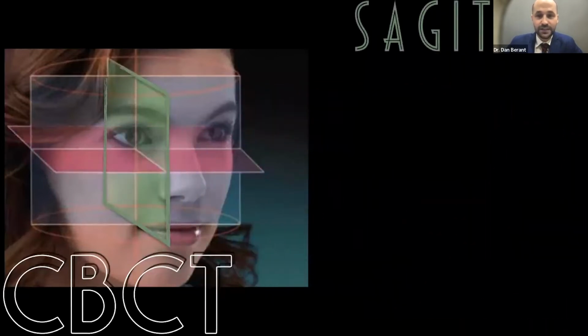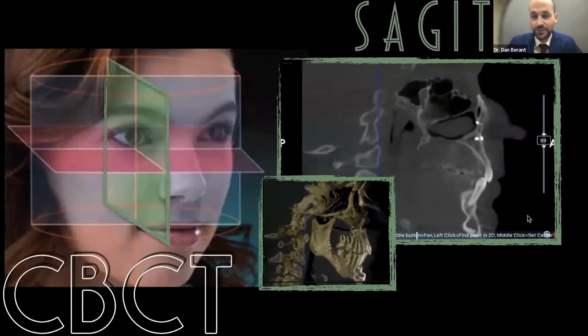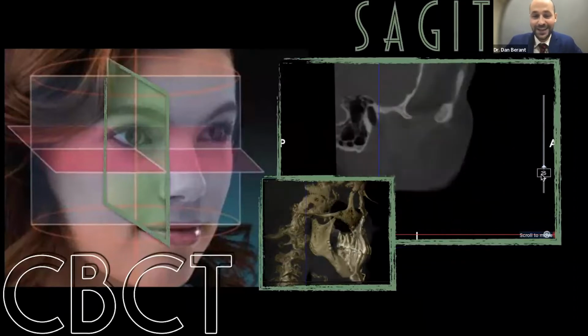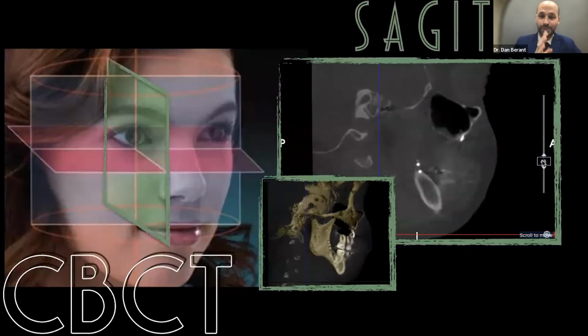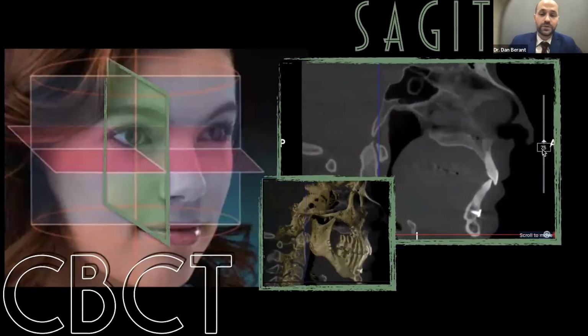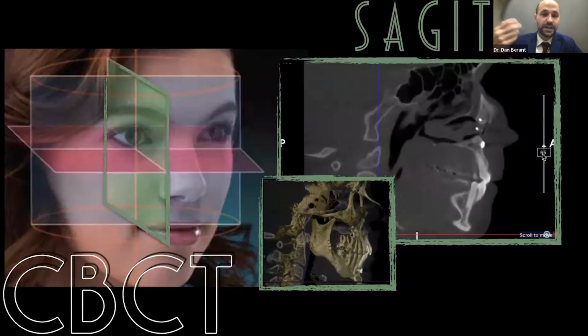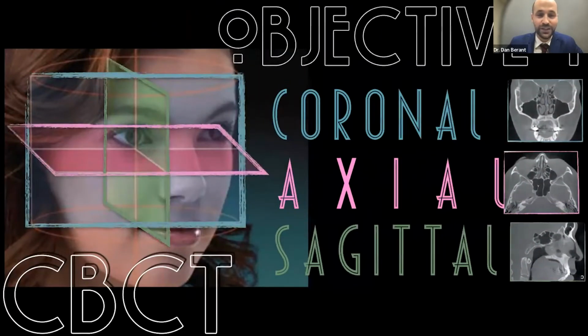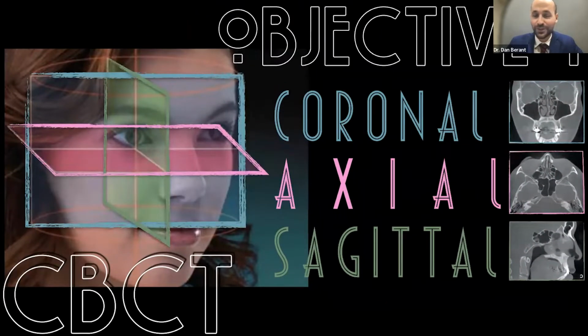And then finally, the last cut is the sagittal. Now, the mnemonic for this is, I don't have one. So sagittal, you just have to think mid-sagittal plane, and then we're going left to right. This is what we would use if we were to extrapolate from a CBCT a cephalometric radiograph, but we will get to that shortly. So here we go. In the first 5 minutes, we have essentially covered the first objective, and now you guys are all familiar with the 3 planes of view: coronal, like a crown, axial, the axe, and sagittal.